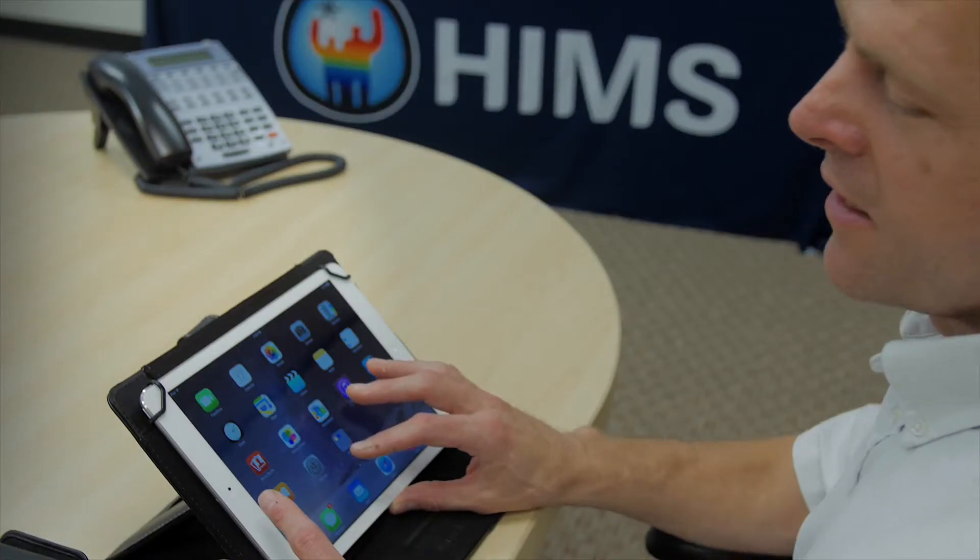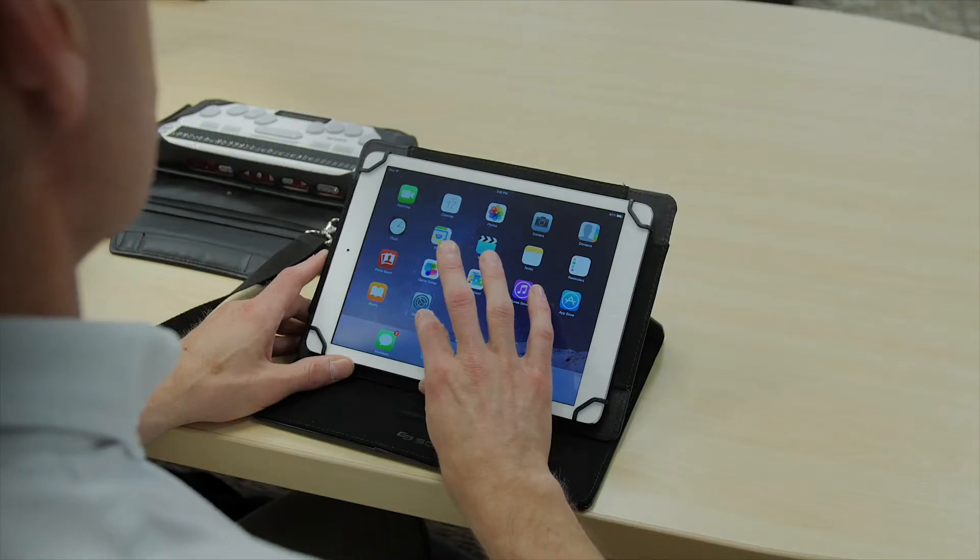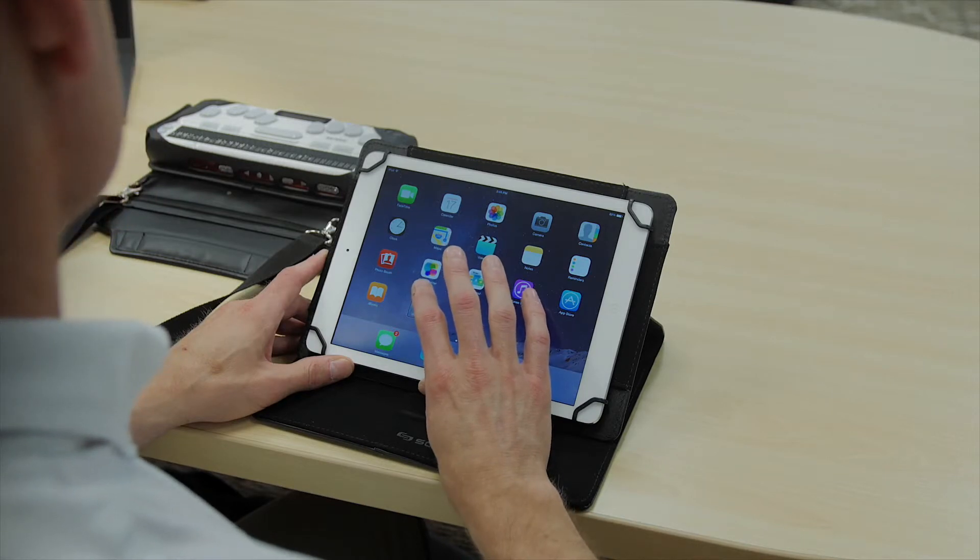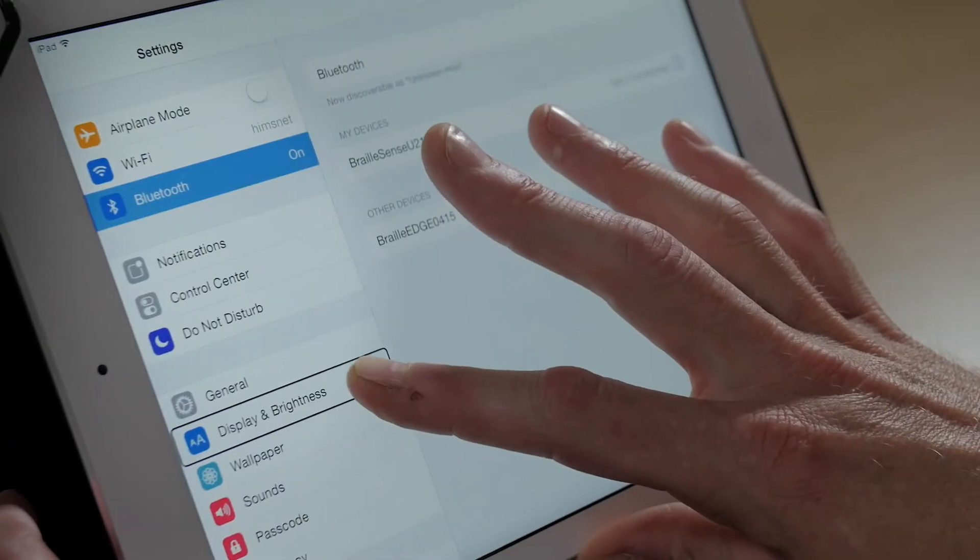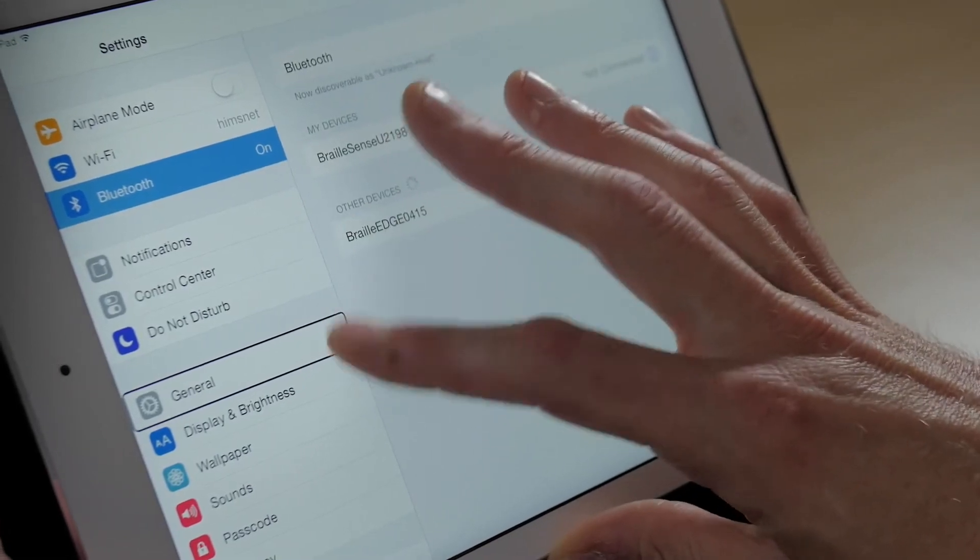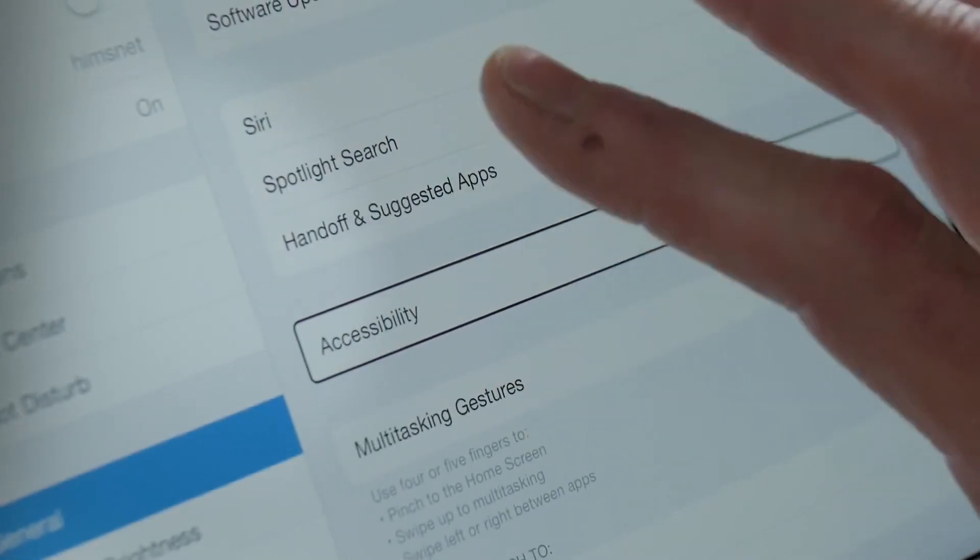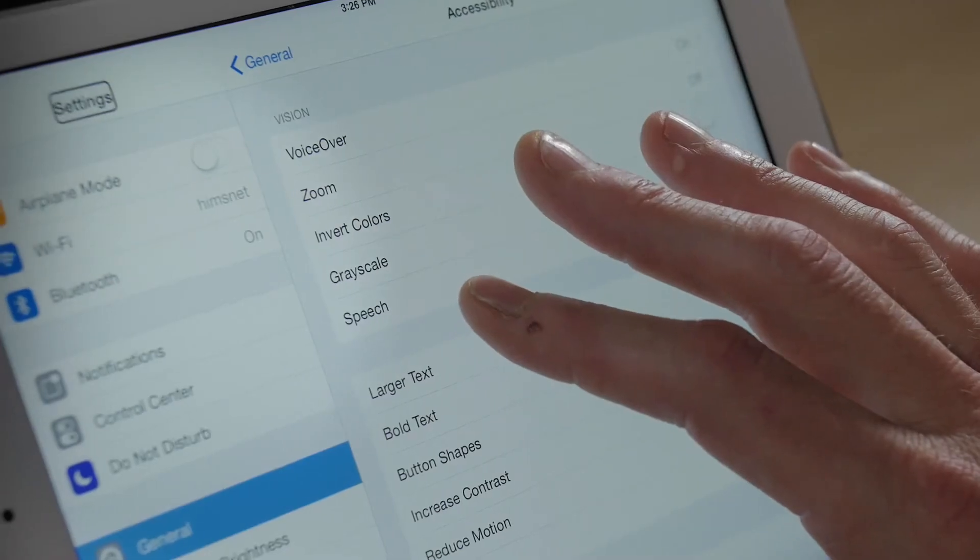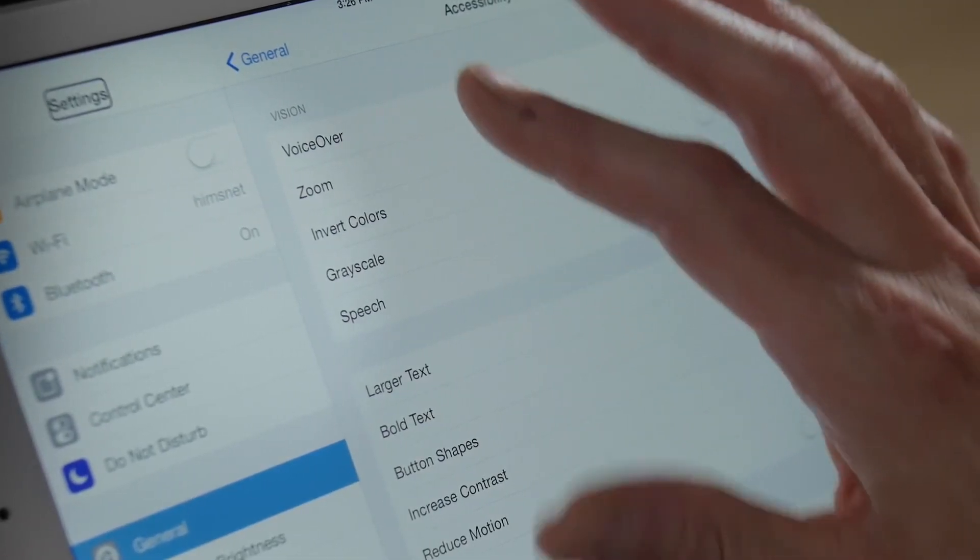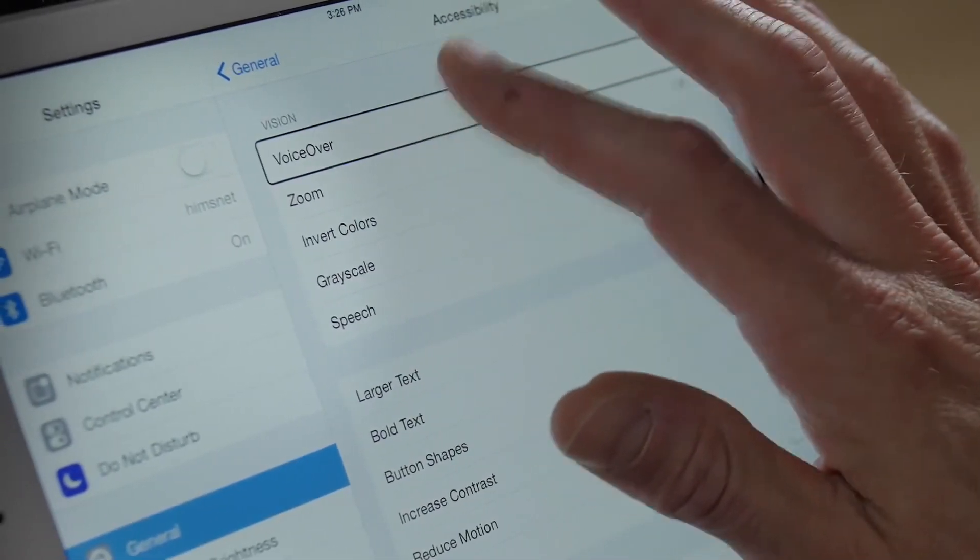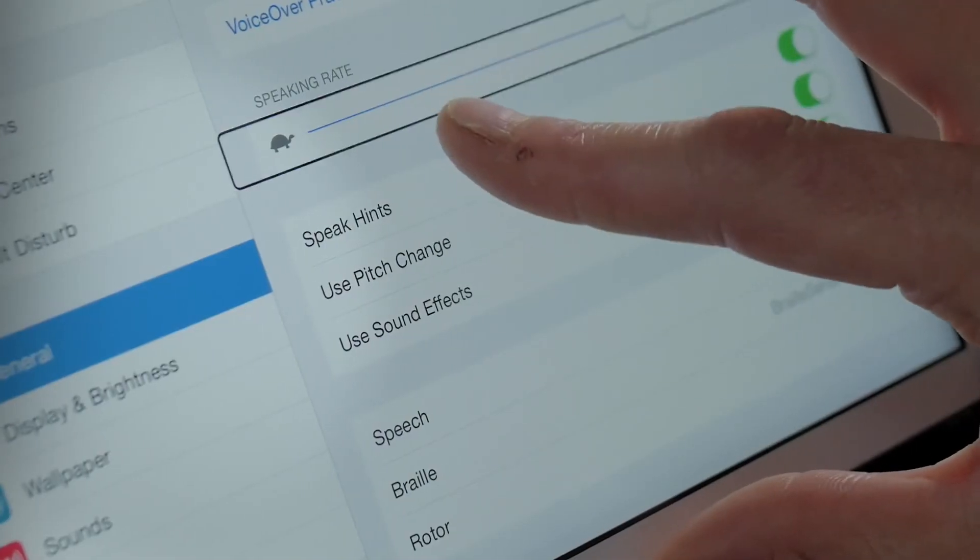So again, we're going to go to settings. We'll double tap on settings. We're going to go to general, accessibility. Under accessibility, we're going to go to voiceover. We're going to go to Braille.